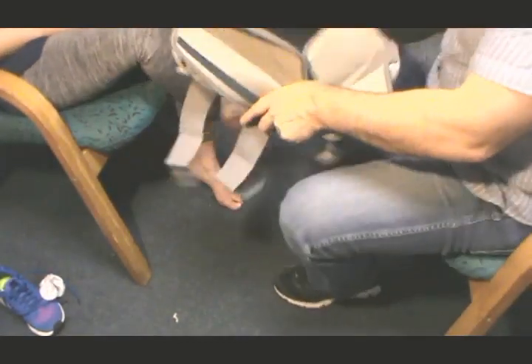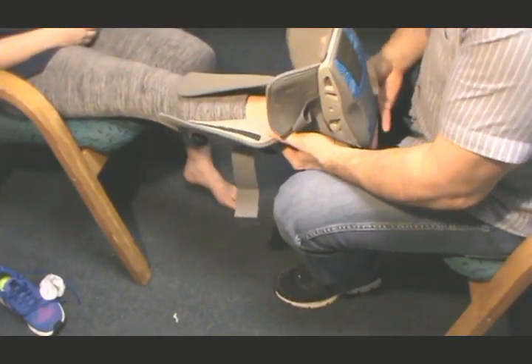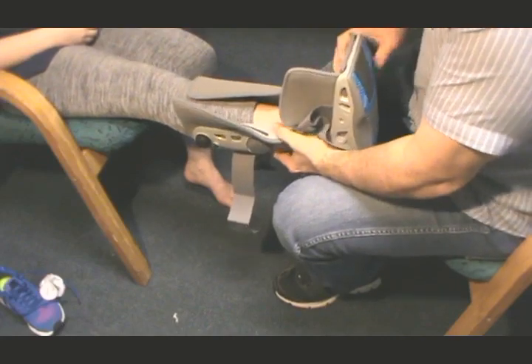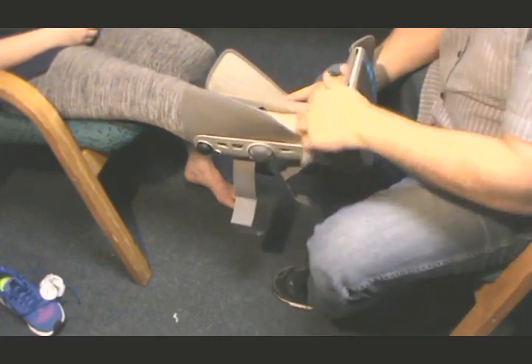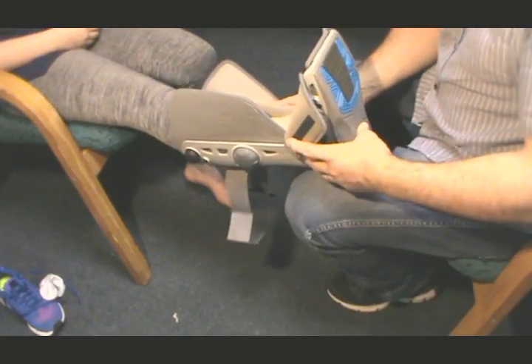Right, so the first thing we do is the patient will lift the foot up and place the foot into the boot. Now, I don't know if you can see that. I can rotate this. How are you going to do this?